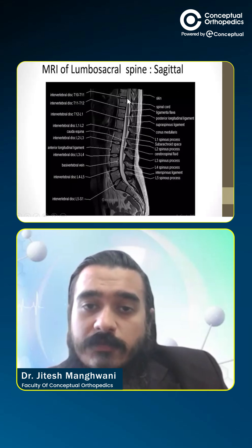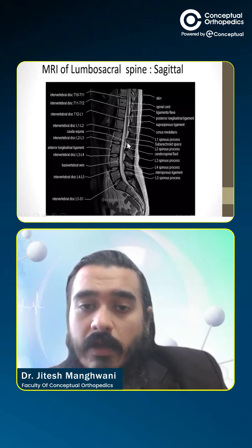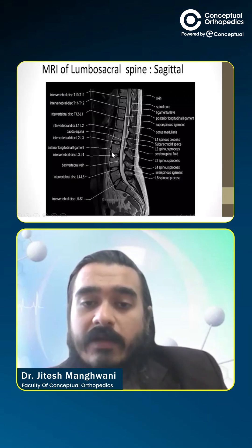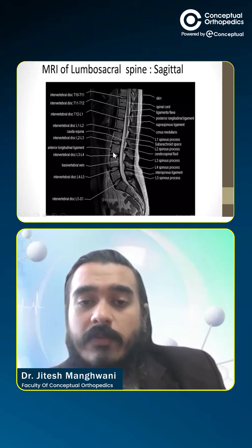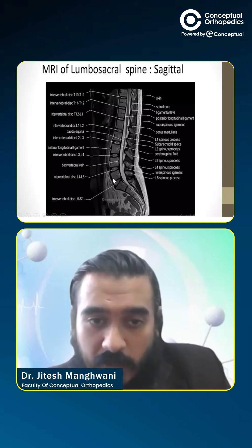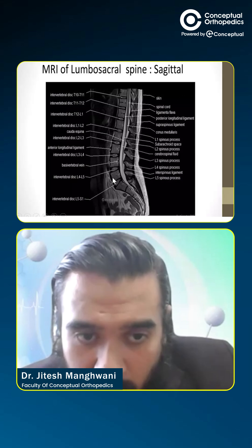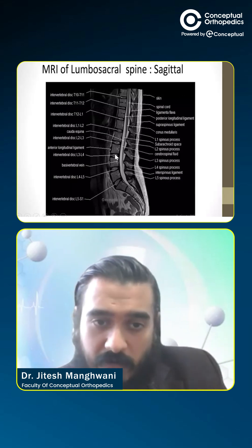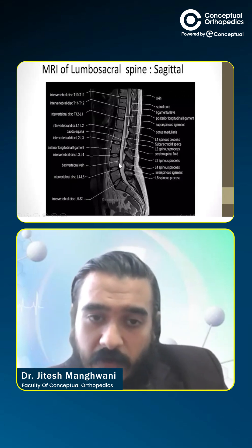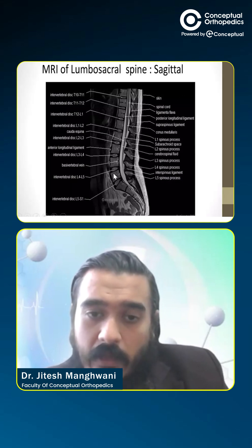This is the disc space present in between the two vertebrae. These are the cauda equina nerve roots. The anterior longitudinal ligament runs through the anterior aspect of the vertebral bodies. The intervertebral disc is here, and the basivertebral vein is present at the mid-vertebral body.